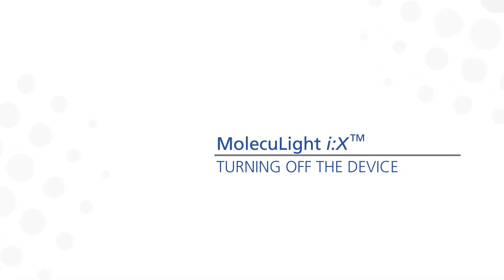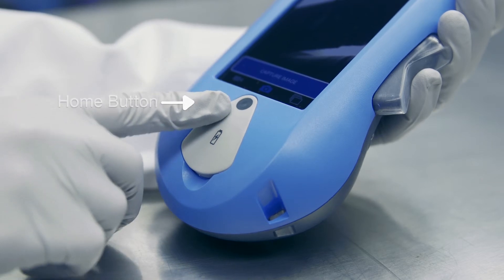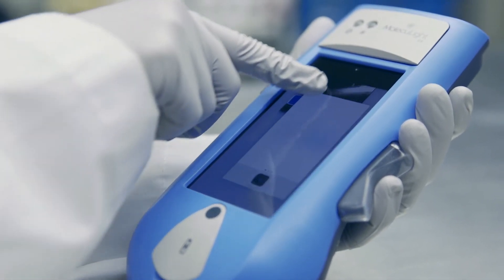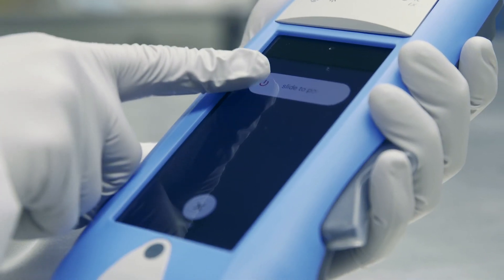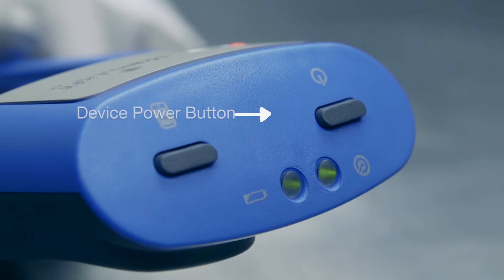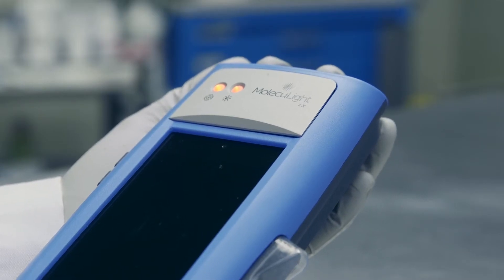Turning the iX off is very straightforward. While the screen is on, double click the home button and slide upwards on the app. Then hold down the display screen power button for three seconds and slide the power off. Lastly, hold down the device power button for three seconds. You'll see that all the LEDs go off, power is off, and you can now go ahead and safely clean the device.